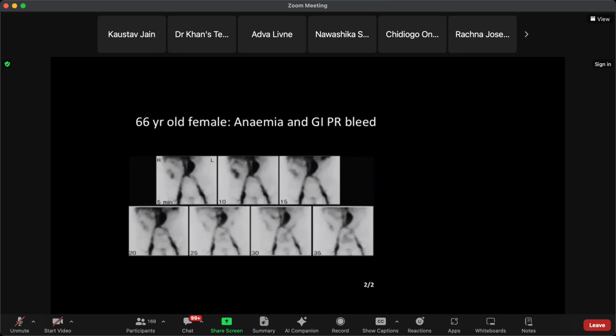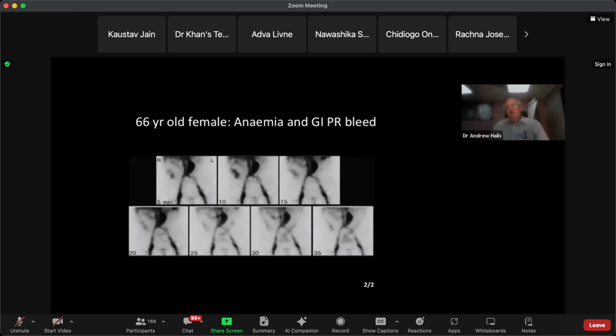So I'm concerned that the abdominal aorta appears to be aneurysmal, and I'm wondering whether there's an aorto-enteric fistula that's causing bleeding. Well, I suppose there could be. I don't think there was. I think the fact the aorta is aneurysmal is sort of incidental, really.